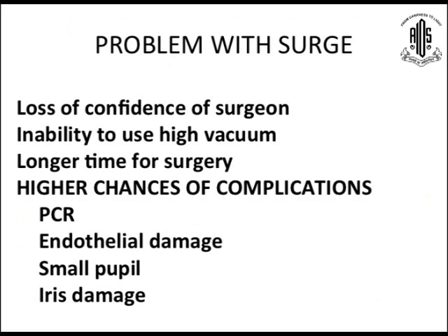The problem with surge is the loss of confidence of the surgeon, inability to use high vacuum, longer time for surgery, and higher chance of complications like PCR, endothelial damage, small pupil and iris damage.